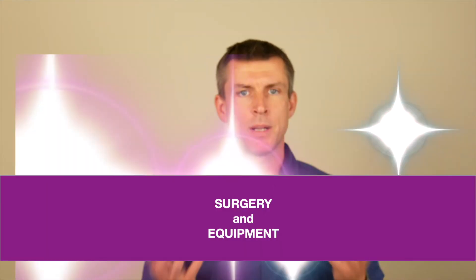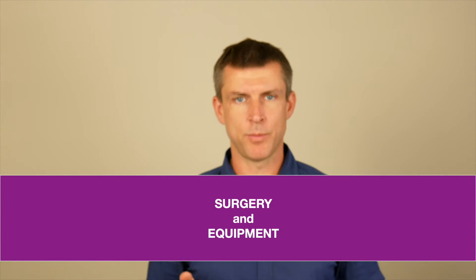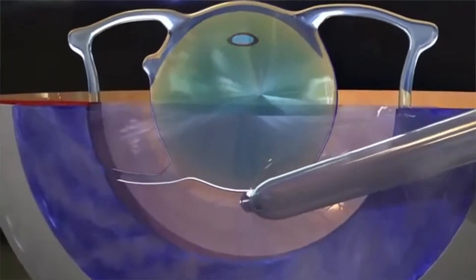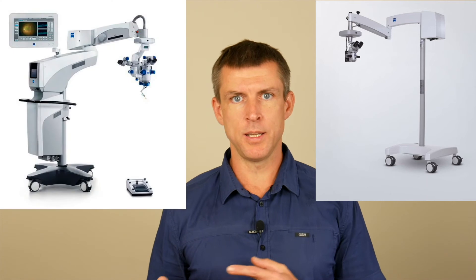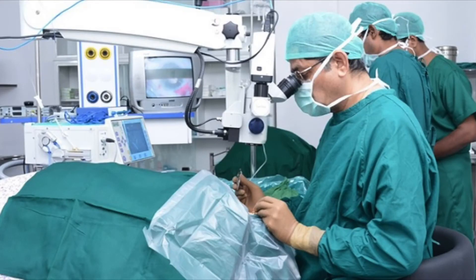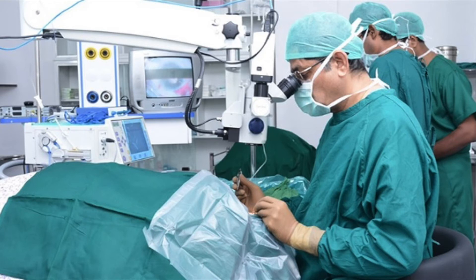Now let's talk about the surgical procedure. Cataract surgery is always performed using a surgical microscope — the type and optical quality of which defines how well the doctor can see during the procedure, and is therefore an important tool for surgical safety. Microscopes can range from simple and inexpensive to advanced and expensive, so the cost of surgery may vary. The patient lies on a surgical bed; in many cases the head is fully covered by sterile tissue and the area around the eye is fully disinfected. You will be covered for only 10 to 15 minutes — it is a fast procedure.